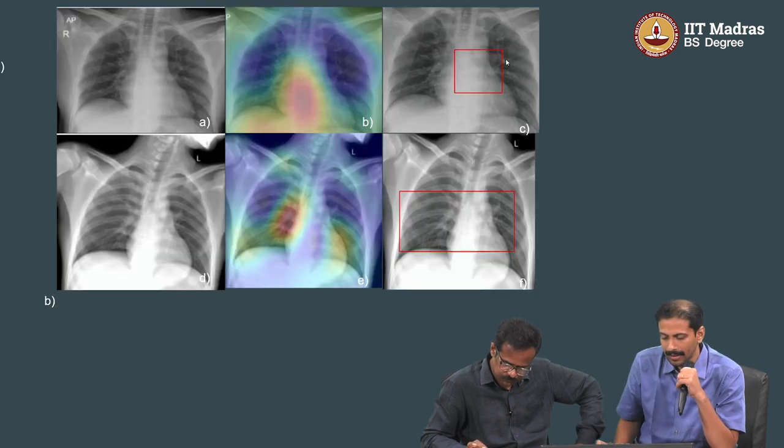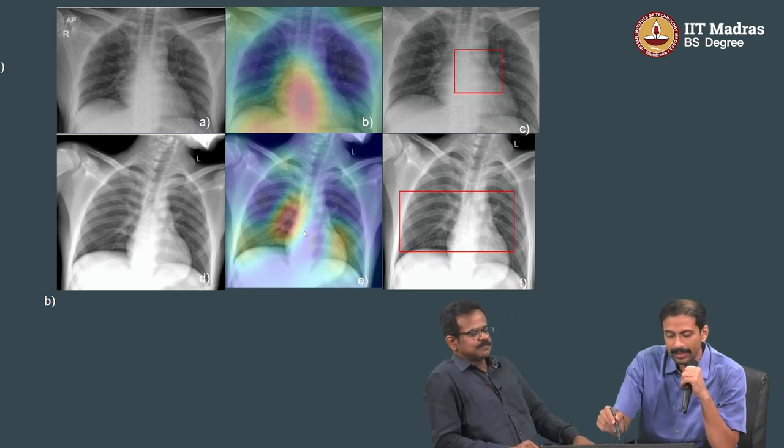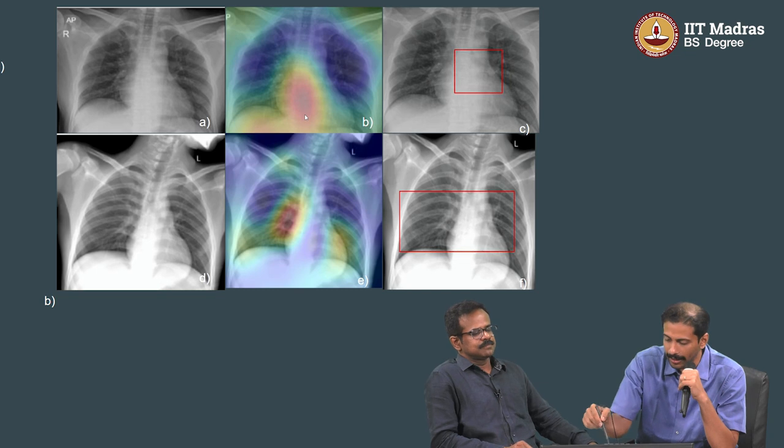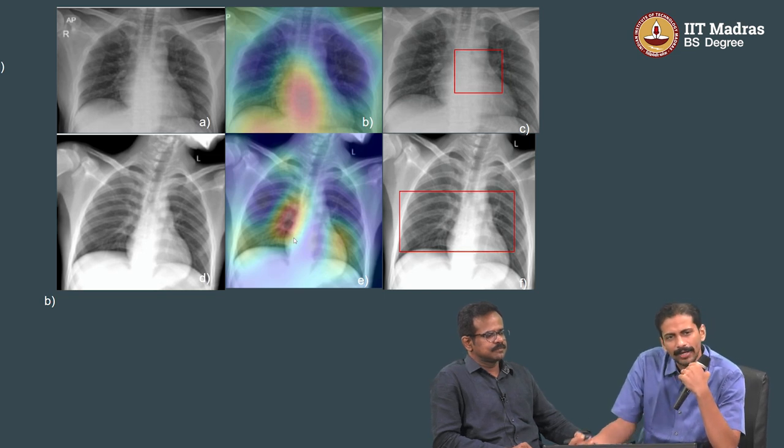But what it also did was, in some patients, it was constantly pointing out the heart area. You all know that COVID is a lung disease. We are also perplexed why it was pointing out the heart.